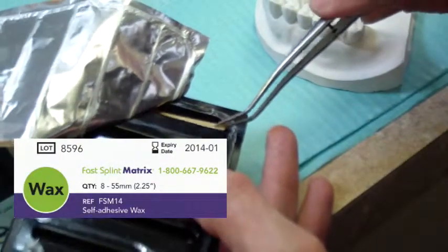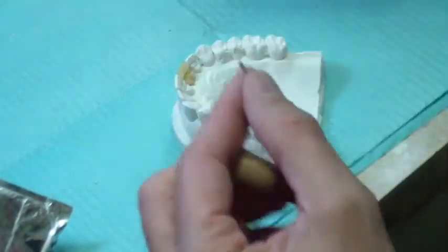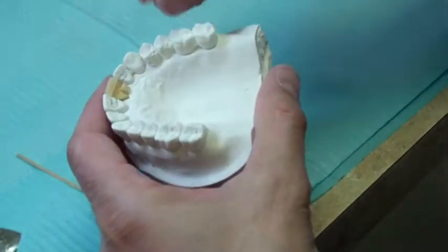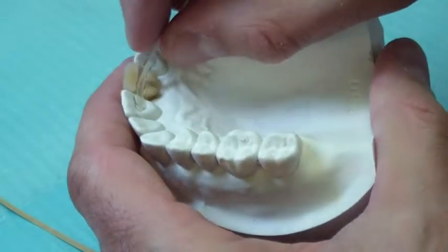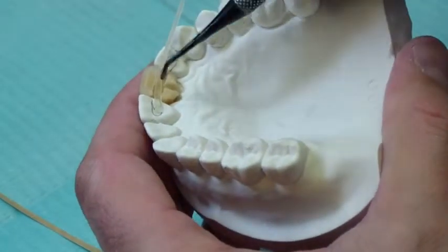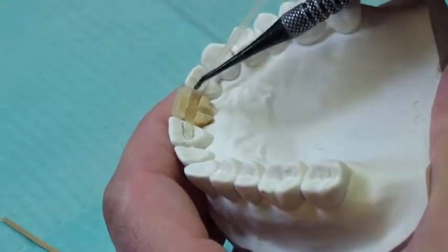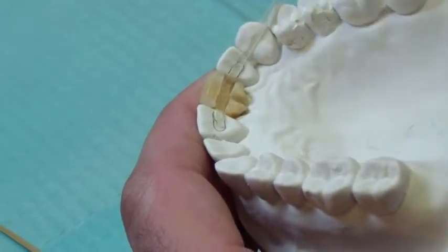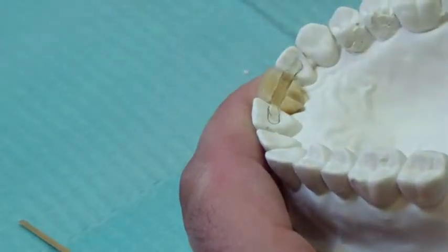Remove a piece of Fast Splint Matrix spacer wax from the package, peel off the paper backing and place the wax, sticky side facing in, into the position marked on the model and demarcated by the channel in the denture tooth. Trim away any excess wax and ensure that the wax space is dry. The wax spacer is placed completely at the base of the channel in the tooth.